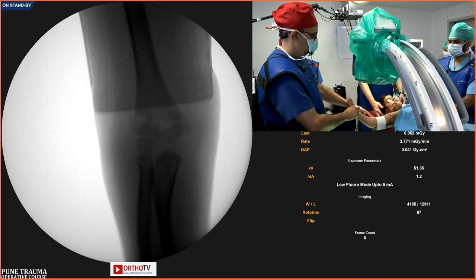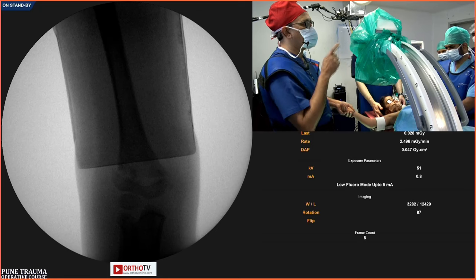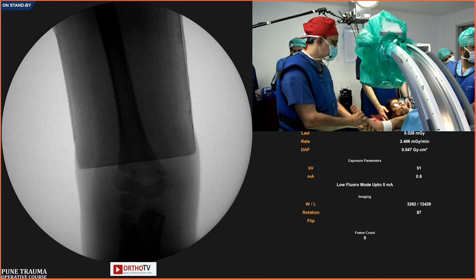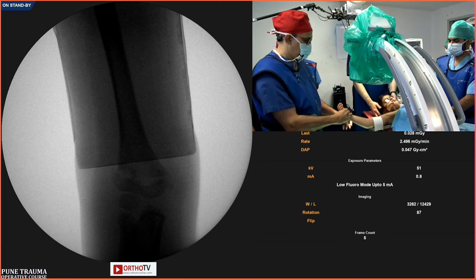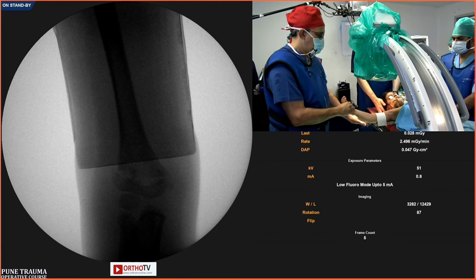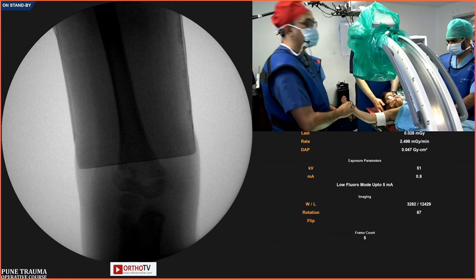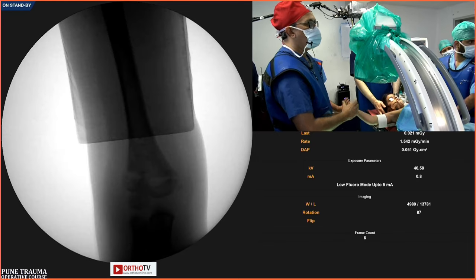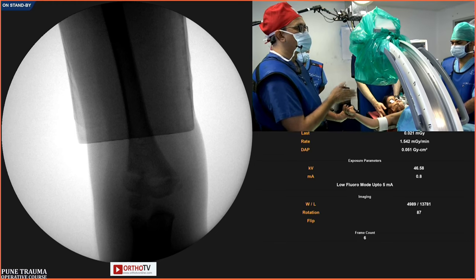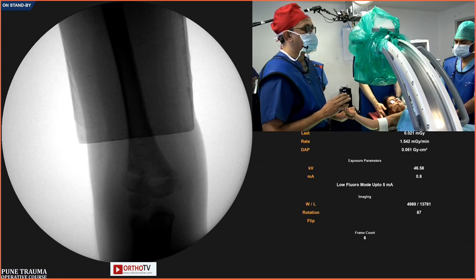So what are your reduction maneuvers? Yeah, so now I'll first show you the C-arm. Can you see the AP now? Yes. So first I'm going to give gentle traction in the longitudinal direction like this. Once I confirm my mediolateral alignment, shoot. More important for everybody to note is the clinical appearance. Don't always look only at the X-ray, because what we are worried about is cubitus varus.